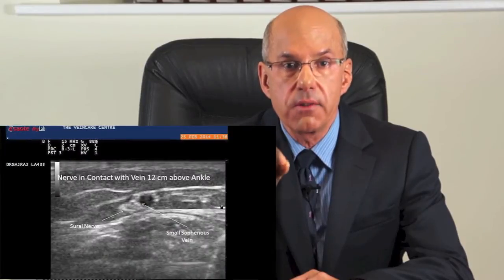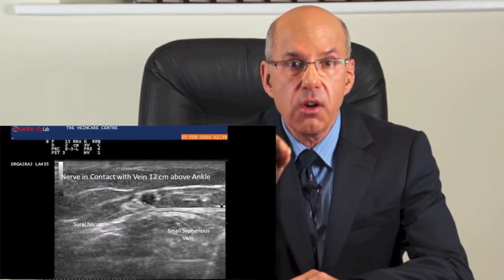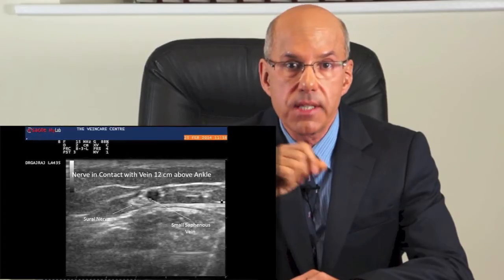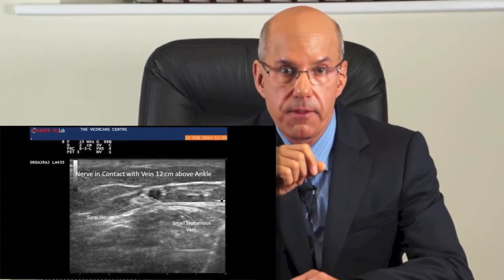In my opinion, the sural nerve should be visualized in transverse section and its relationship to the vein established at the proposed point of vein cannulation. Here you can see that the vein and the nerve are very close and in contact in the distal calf, here at 12 cm above the malleoli.